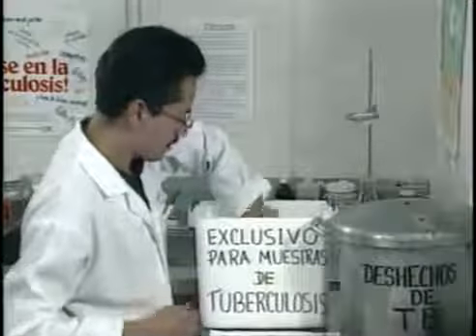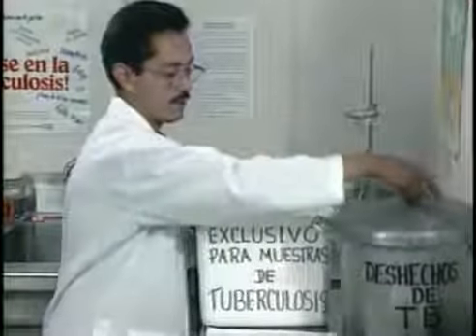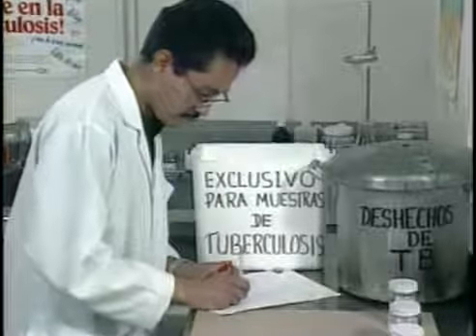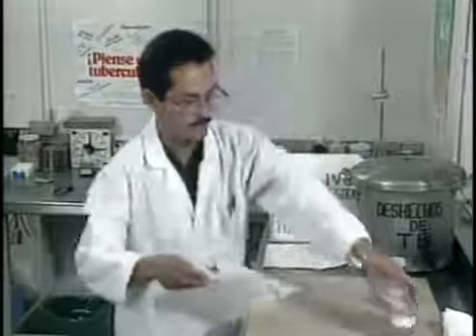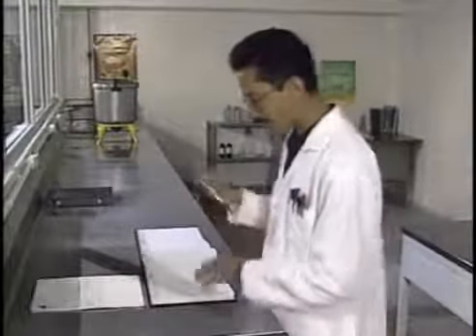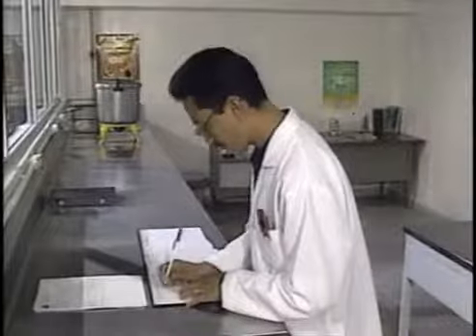Open the transport box carefully and examine it for cracked or broken containers. Discard any broken or leaking container and request another specimen. All specimens must correspond with the accompanying list containing data of the TB suspect. Once verified, record all information in the laboratory register. The WHO or IUA-TLD laboratory register is strongly recommended as a guideline. The format of the register should never be altered.